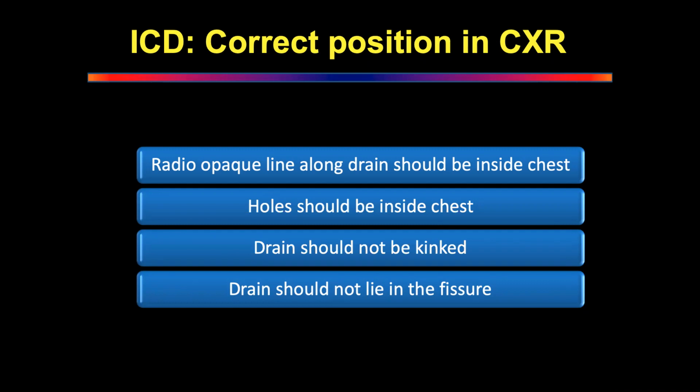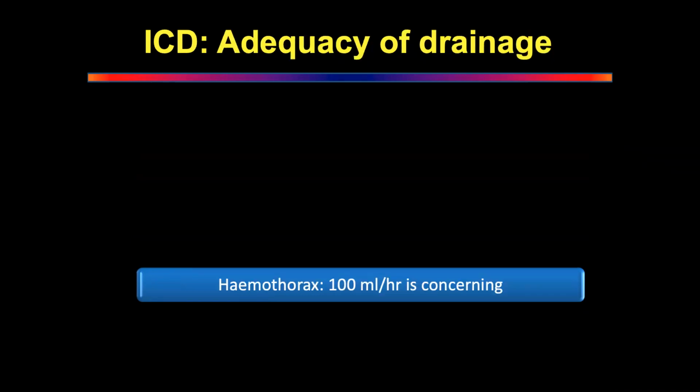Okay? All right. Next. How do you ensure adequacy of drainage? On X-ray, the lung is expanded.